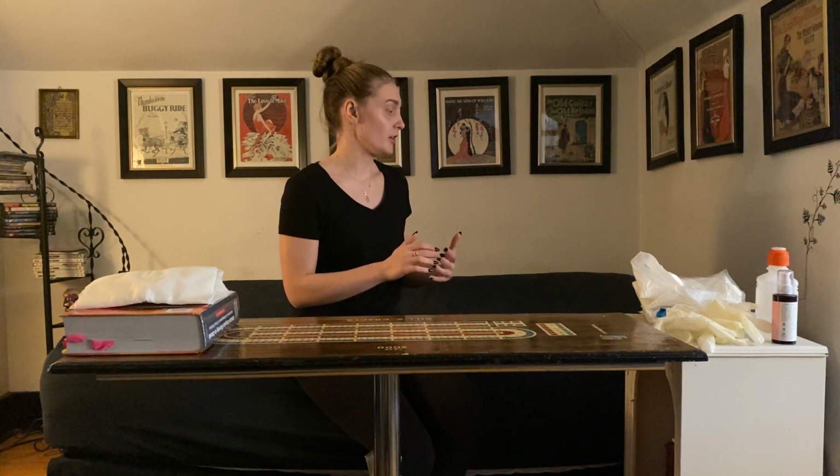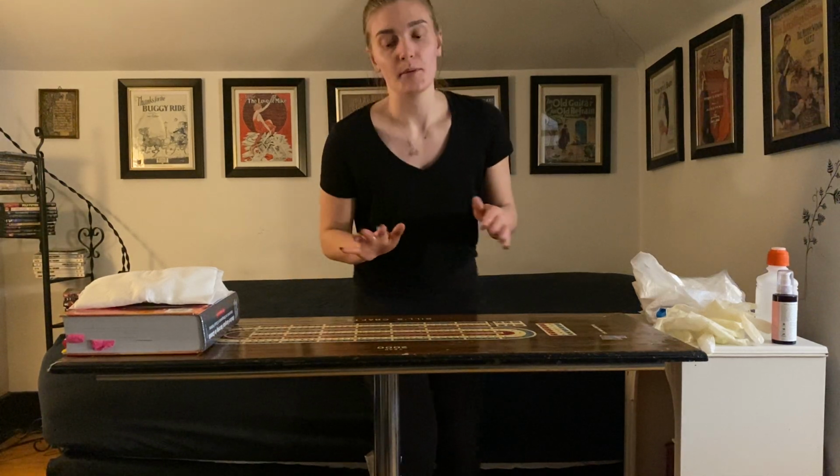So today I'm going to be performing a dressing change on your abdominal wound. So just taking the old dressing off, irrigating it with normal saline, so essentially cleaning it, and then putting a new dressing on. Is that still okay to do? Okay, great. So I'm going to start setting up my sterile field.